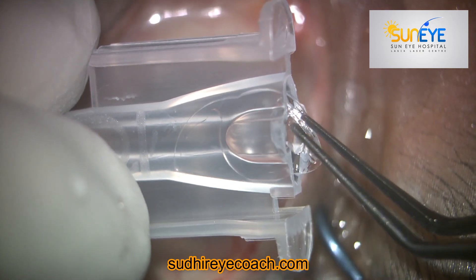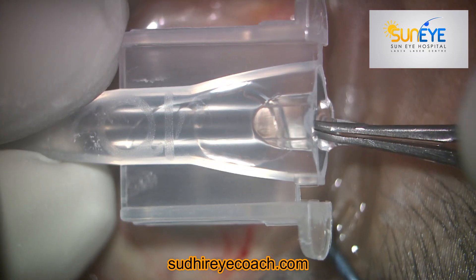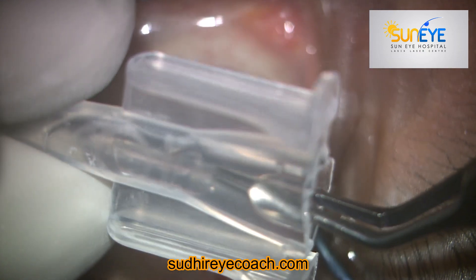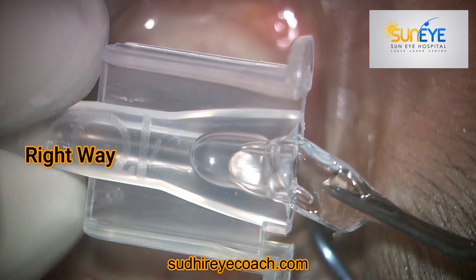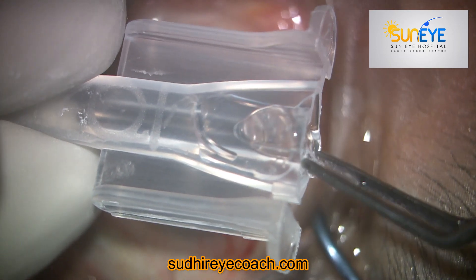If you push the lens directly into the cartridge, you can see that the leading haptic is straight. If you enter the eye this way, that leading haptic will hit the posterior capsule and create a problem. So try to push the haptic onto the anterior surface of the optic — that is the correct approach.